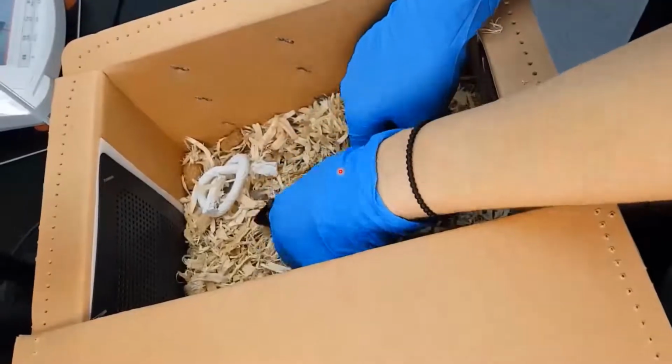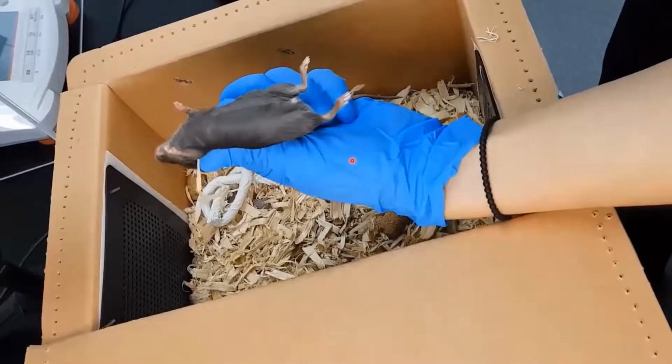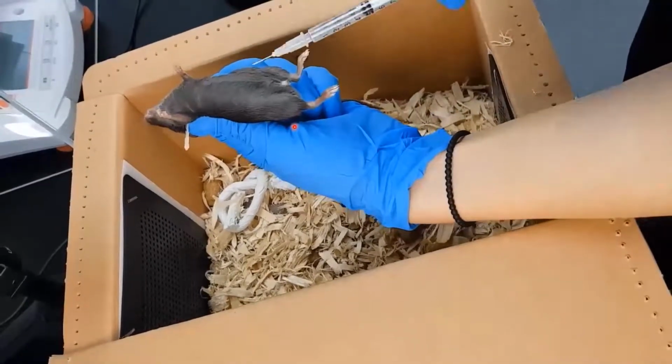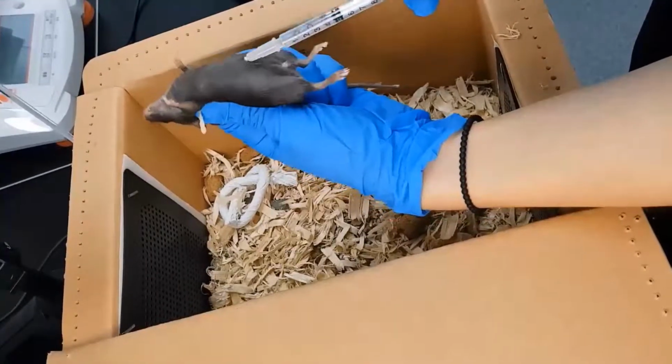From this slide, I'd like to discuss experimental methods of the animal manipulations for in vivo imaging of various organs using the IVIM system. The first topic is ear skin imaging. The ear skin is the easiest organ to visualize without additional surgical procedures.